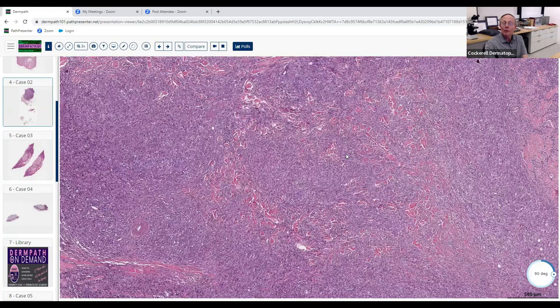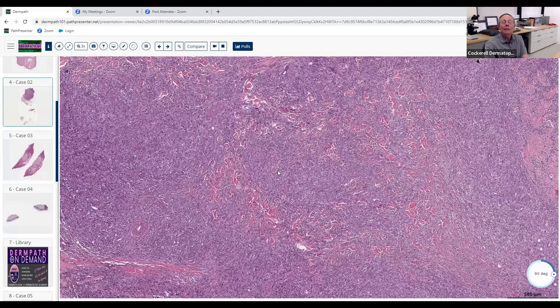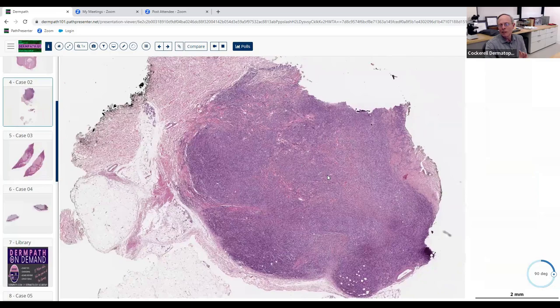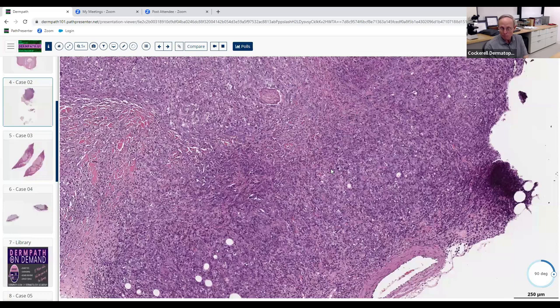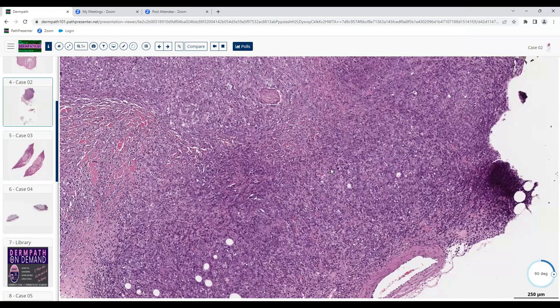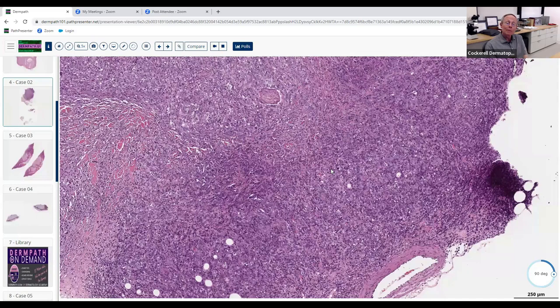Let's talk about the differential diagnosis for a CD30-positive lymphoid neoplasm. Name two or three other things you have to put in the differential when you see histology like this with CD30 positivity. You could think of mycosis fungoides — but does all MF have CD30-positive staining? Perhaps not.